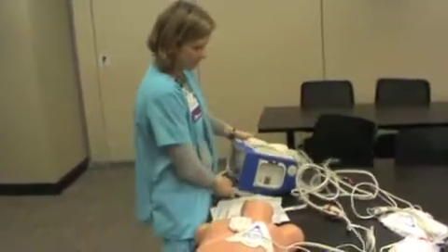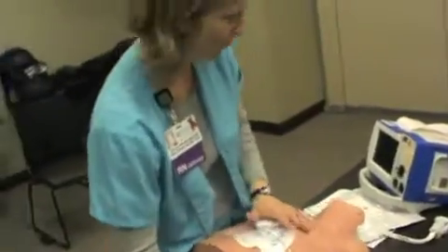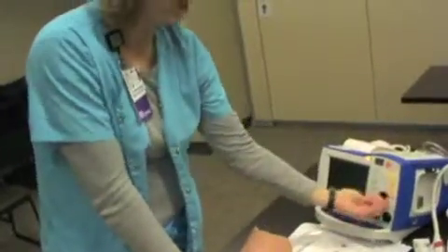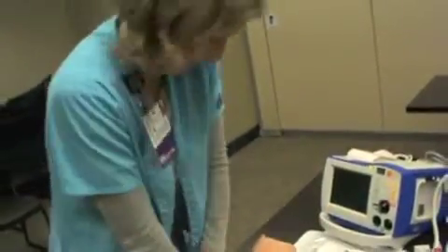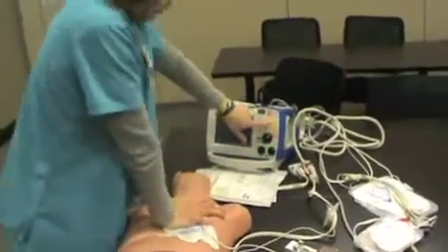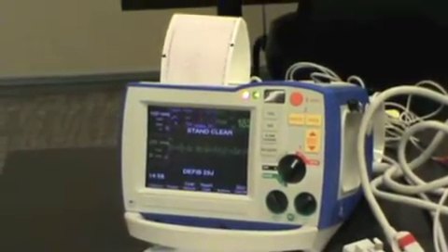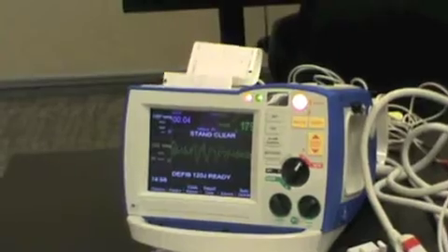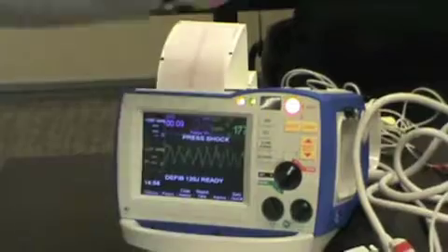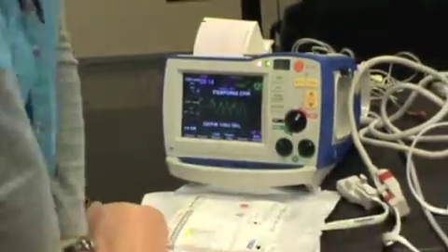So as soon as the defibrillator arrives, hopefully I'll have a buddy to help me putting on the pads appropriately. And I'm gonna continue CPR while I turn this monitor on, flip it right to defib. Okay, as soon as it's on, I'm gonna hit analyze. Analyze tells me to stand clear. Now that button is lit up, telling me to shock it. Clear the patient, deliver the shock. Perform CPR. Right back on the chest.